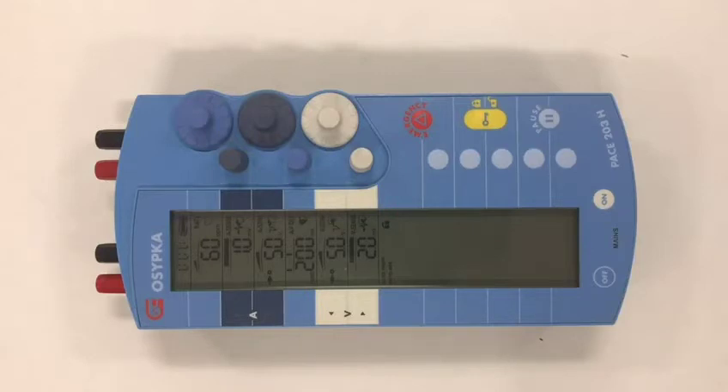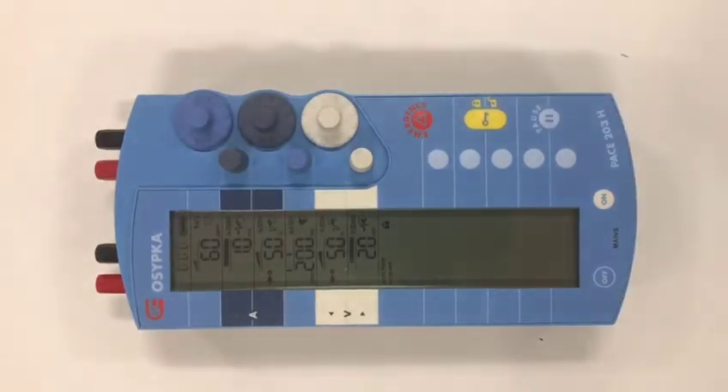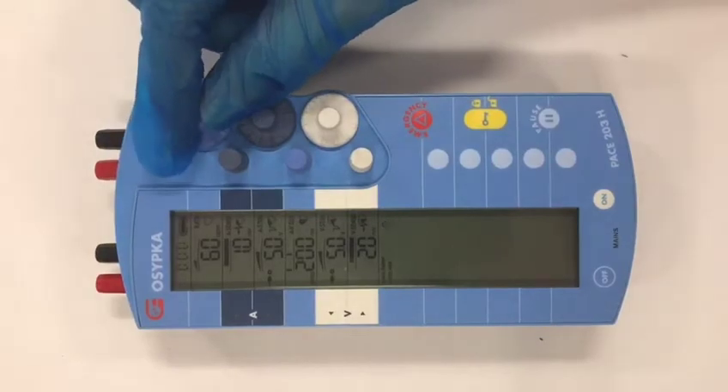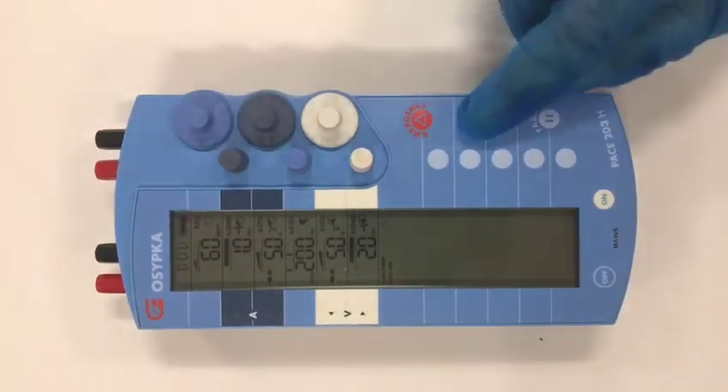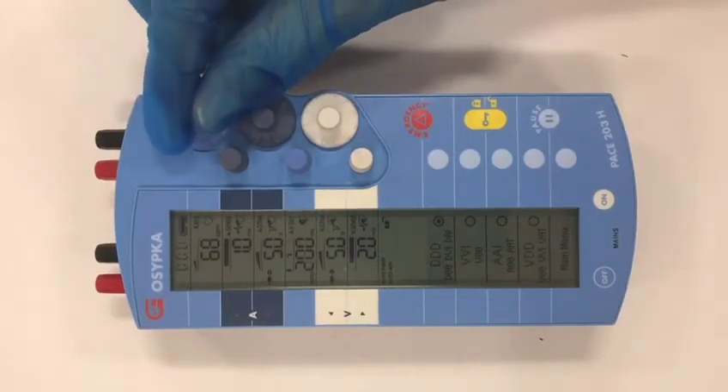The second thing you need to know is the yellow button. None of the parameters are changeable unless you unlock the device first. For example, if I try to change the rate, I can't. I have to unlock the device before I can change the rate.